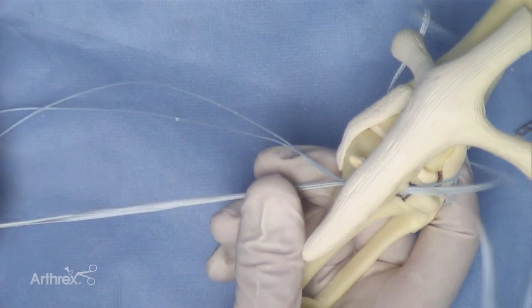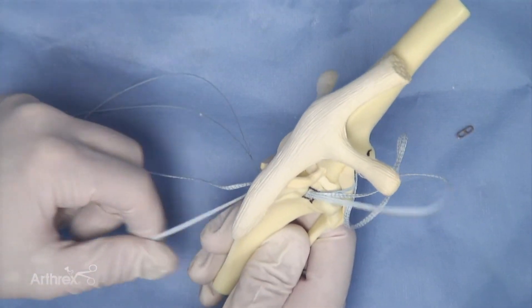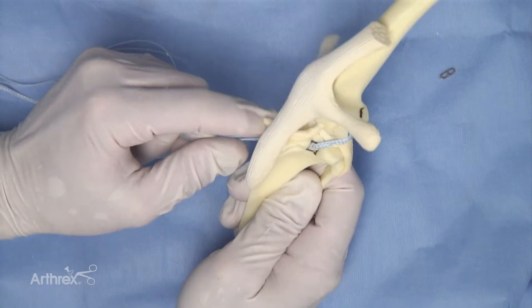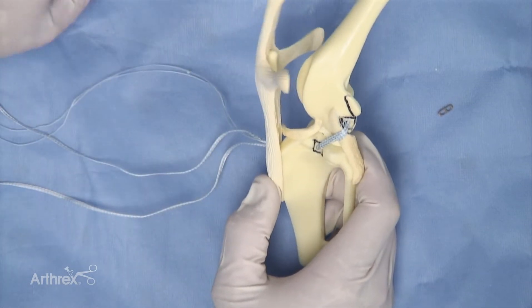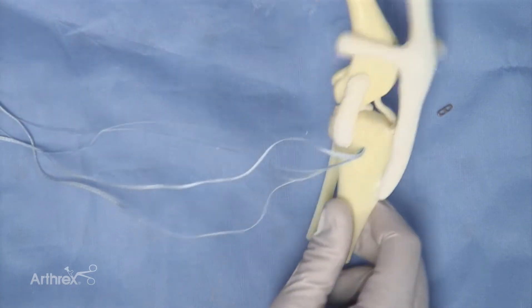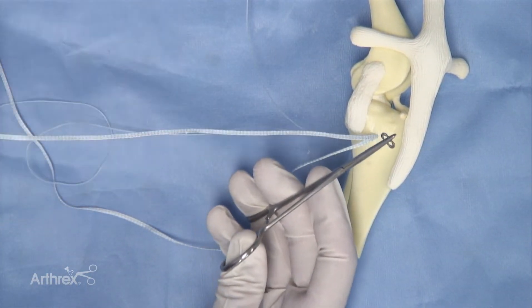It is important during this process that the material runs in a flat and non-obstructed fashion. Some twisting of the material may occur and should not be stressed about. As you can see, the implant is now sitting on the lateral side from the femoral socket to the origin of the tibial tunnel. The model is then rotated where a hemostat will be used to hold the two-hole button.